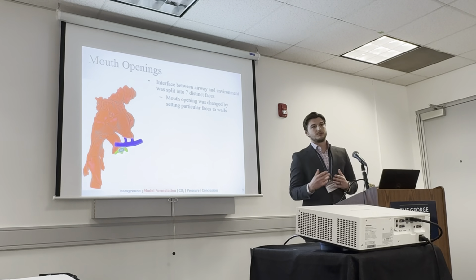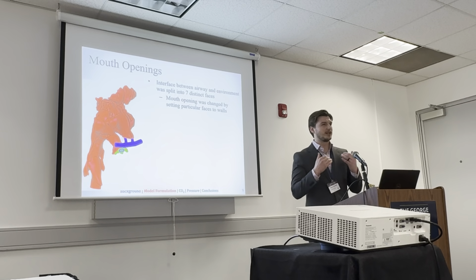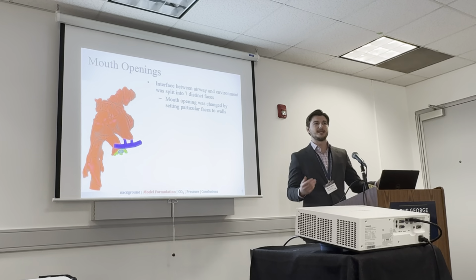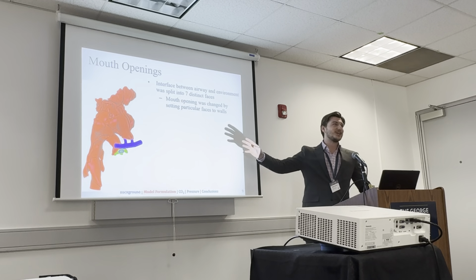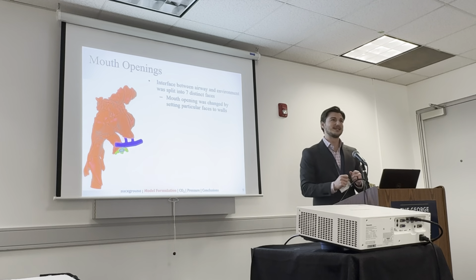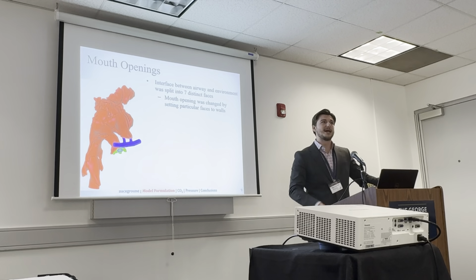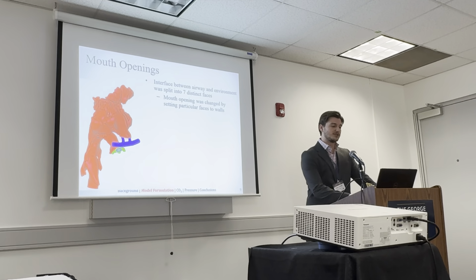So you might be thinking, this is CFD. You're saying you're going to be opening and closing the patient mouth. Is that going to involve remeshing, which would then introduce additional uncertainty? Because with the airway here, you're not going to be able to get a really nice structured mesh where you know exactly what's going on if you open the patient mouth a little bit and then remesh. So we wanted to avoid any unnecessary uncertainty.